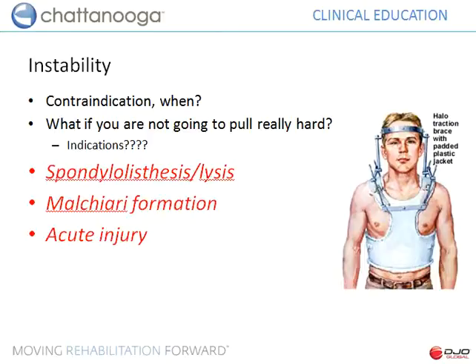So, in fact, when I first started with the newer tables and my different thought process, I actually had a basketball player, an American basketball player with spondylolisthesis and spondylolysis and 2 levels of disc herniation, and he was injured acutely. And so the idea was, well, if I don't want to pull him too hard, maybe I can pull him with much lower intensities and create a suppression in motor neuron excitability, which would further suppress his muscle spasm or hypertonicity. And in fact, when we do that, it actually creates immobilization, especially when you use static, which is the reason I choose to use static during those early stages of acute injury.